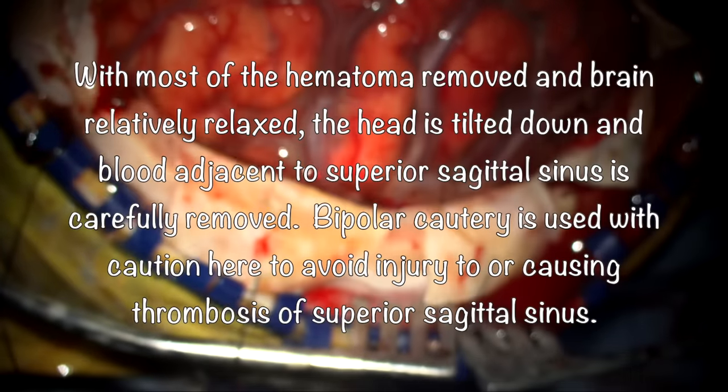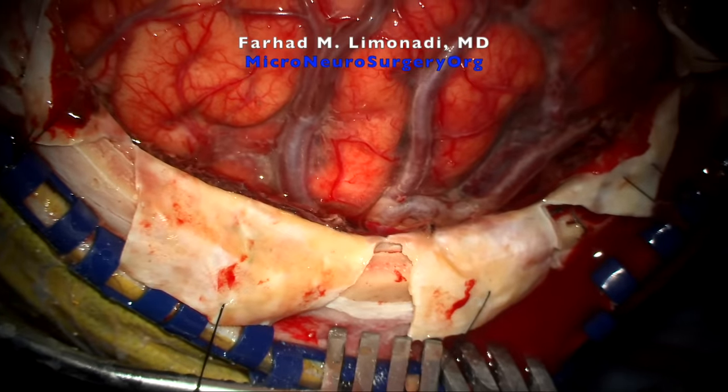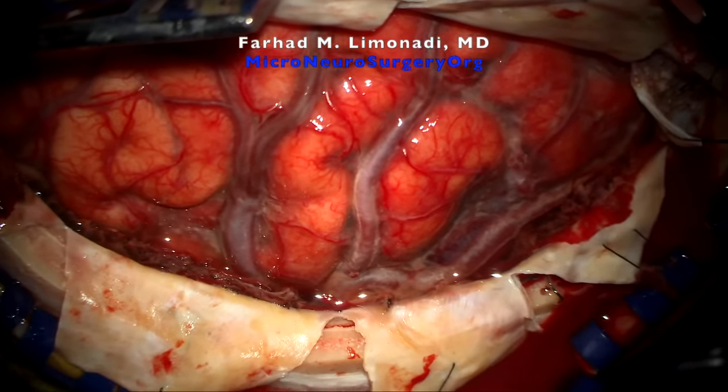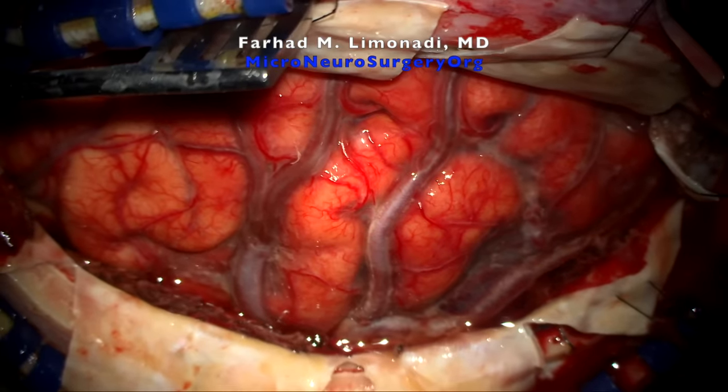With most of the hematoma removed and brain relatively relaxed, the head is tilted down and blood adjacent to the superior sagittal sinus is carefully removed. Bipolar cautery is used with caution here to avoid injury or causing thrombosis of superior sagittal sinus.